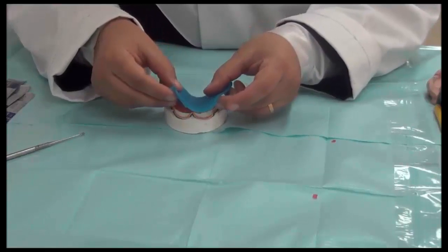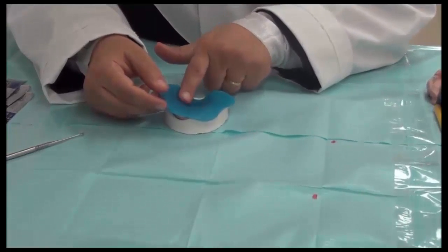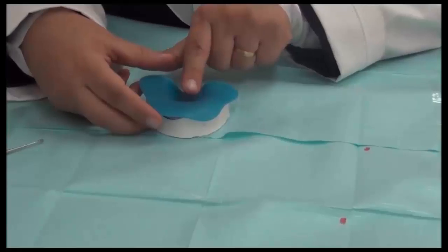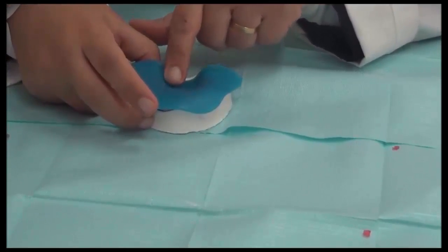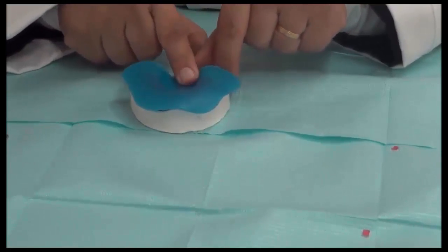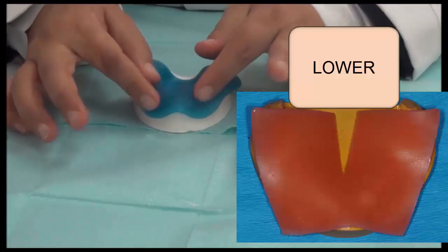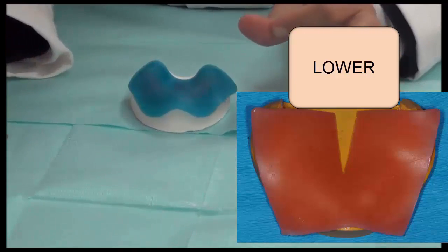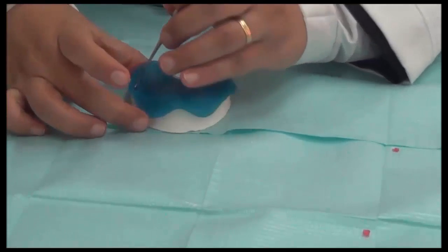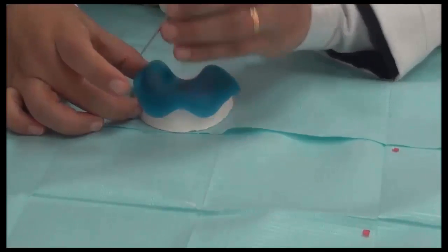So when we are going to do our steps, we are concentrating that you once more adapt but not press or thin the material. So we're going to adapt the material with our fingers from the palate first, then over the crest of the ridge. We're simply removing any voids or any air trapped inside, and then we run from the crest downwards. To adapt inside the sulci, we could use the back of a lacquer carver or the back of a wax knife to press the material inside the sulcus and against the tissue in this area.